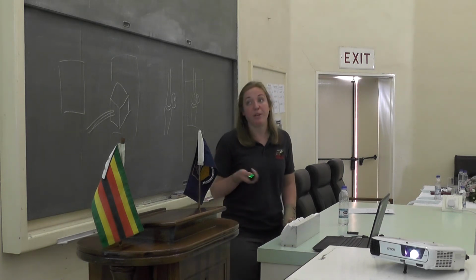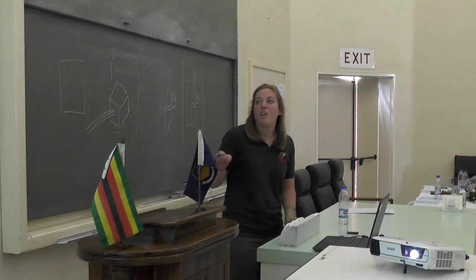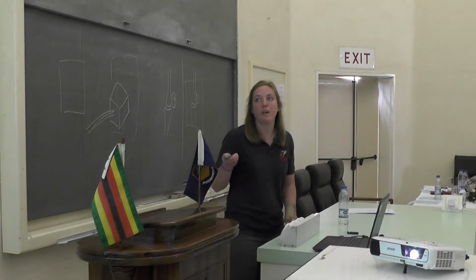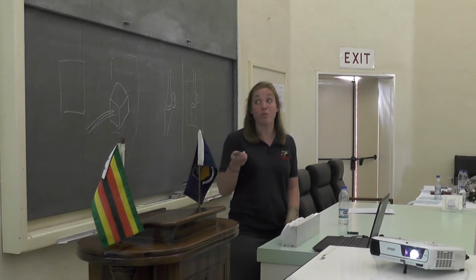And then, this is the fun bit where you can just do other views. If you think about your lateral medial, there's the amount of the metacarpus or the metatarsus that it allows you to see, but you can't really evaluate the bone surface that's hiding in the actual joint. So you can do, for example, the flexed view. You can open up a lot more of that joint and look at other bits of the condyle that you could otherwise not see. So again, you can explore. You need to know what you're looking for, where you might be looking for it, and then try to come up with a view that will show that the best.